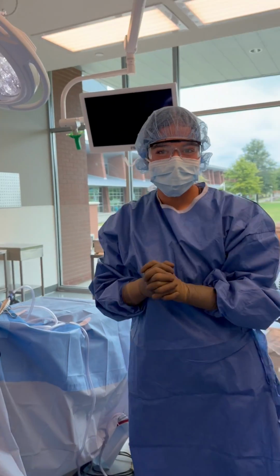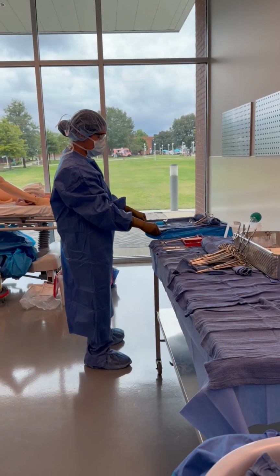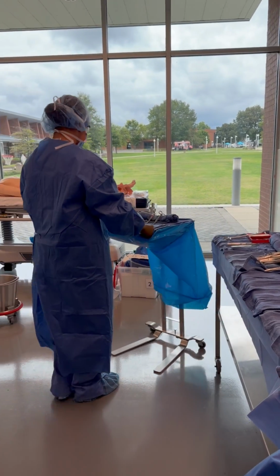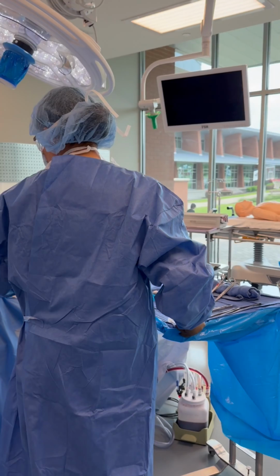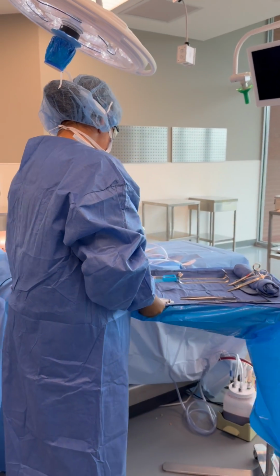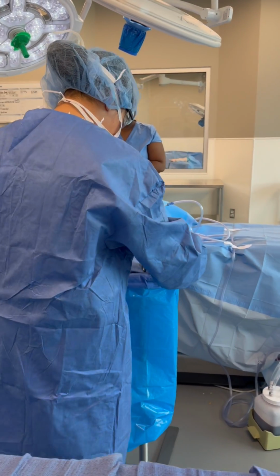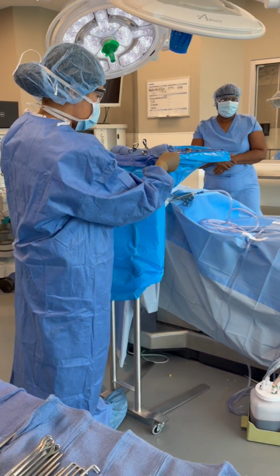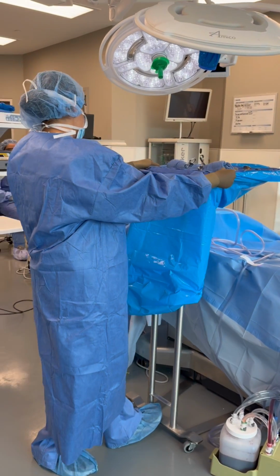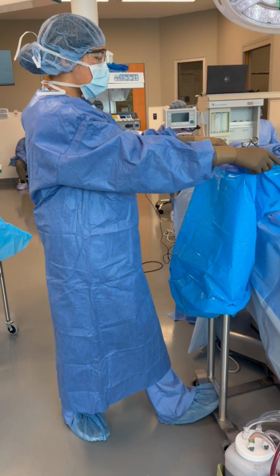After that, we're going to move the Mayo stand. I'm going to bring it over here. Since the surgery is going to happen in the abdomen, I'm going to put it right here. I'm going to lift it up. Let me adjust it, not too high.